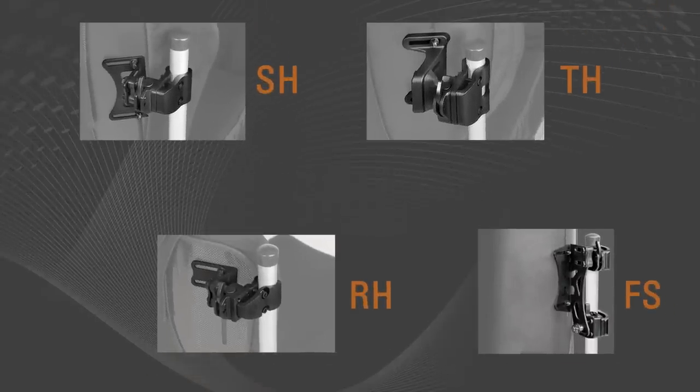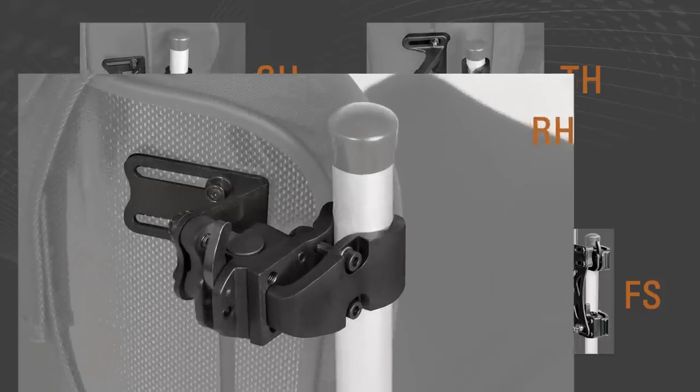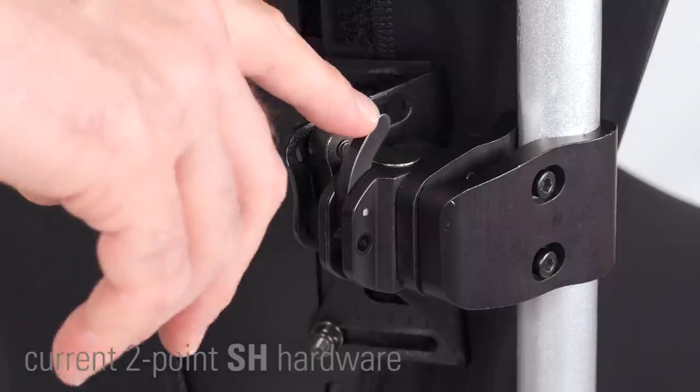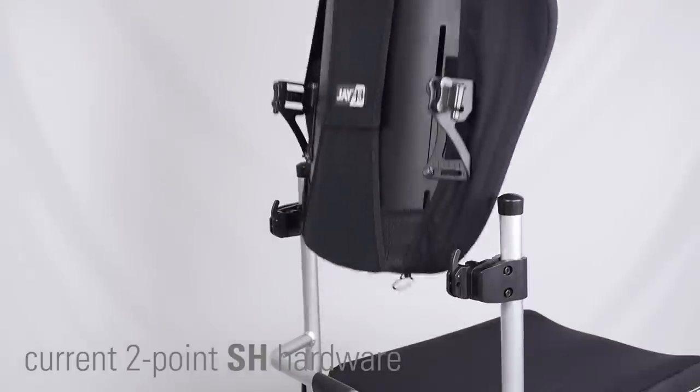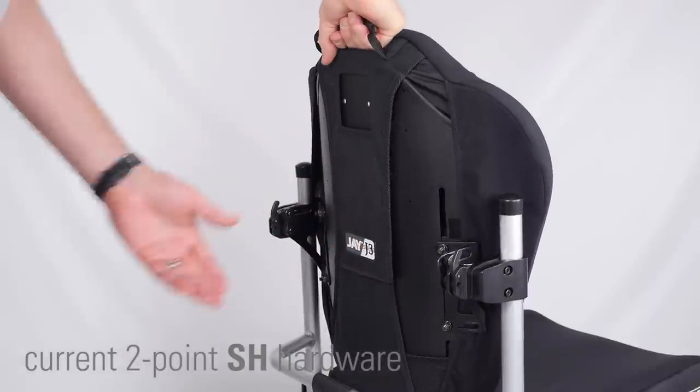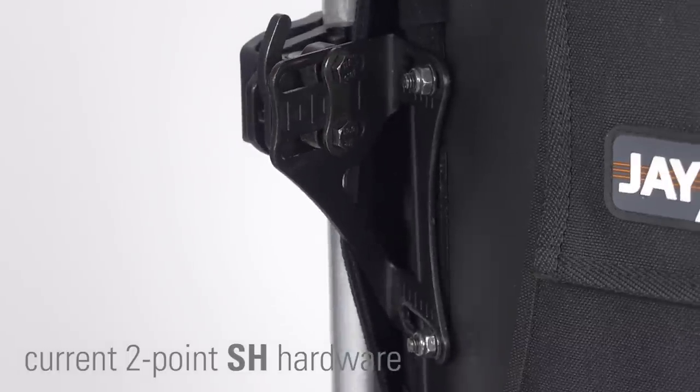Let's take a look. The first addition is a lightweight version of the current 2-point SH hardware. People love the ease with which our current 2-point SH hardware removes and reattaches to the wheelchair, and they like its extensive adjustability.